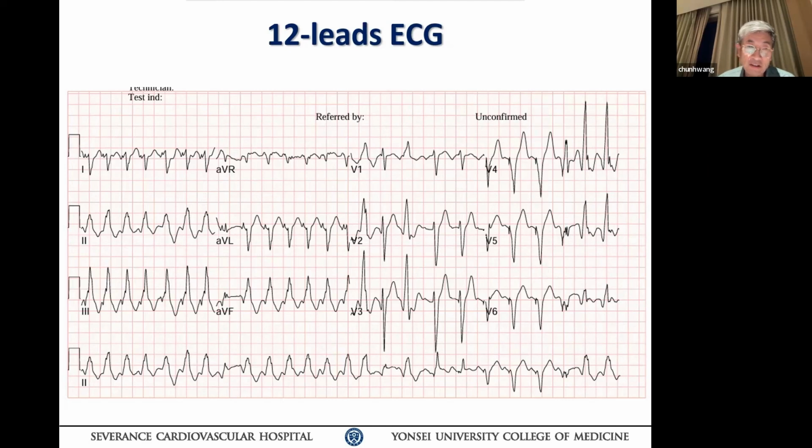I think we need to discuss this systematically. These are quite complex EKGs. So did anybody think about the possibility that this could be aberrancy?